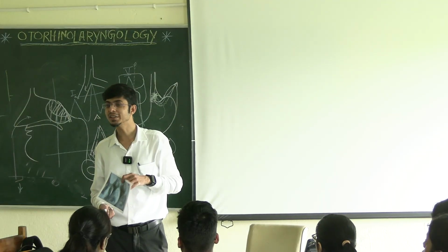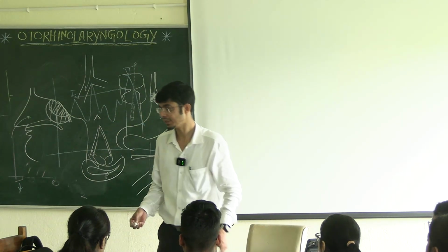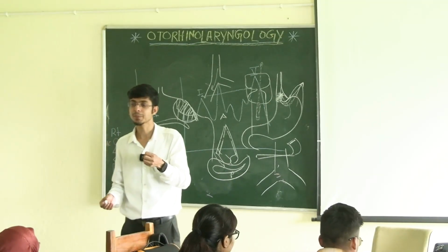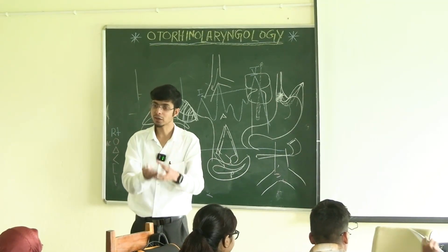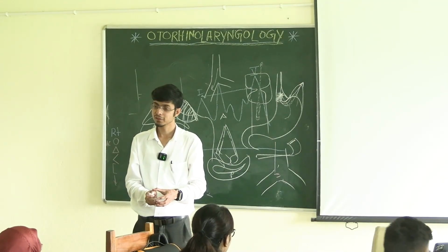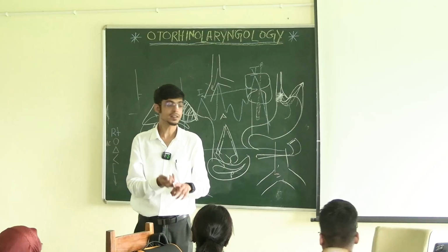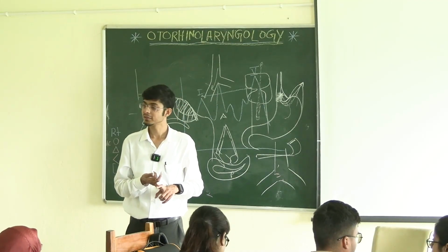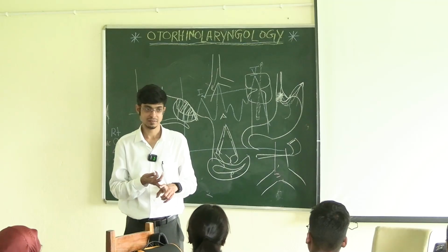Barium swallow is something that may not help, because barium swallow is a liquid, right? It's a fluid. So if you have a foreign body, the fluid can go around it and make it completely opaque. First. Second, the foreign body may not be radio-opaque. It can be anything.